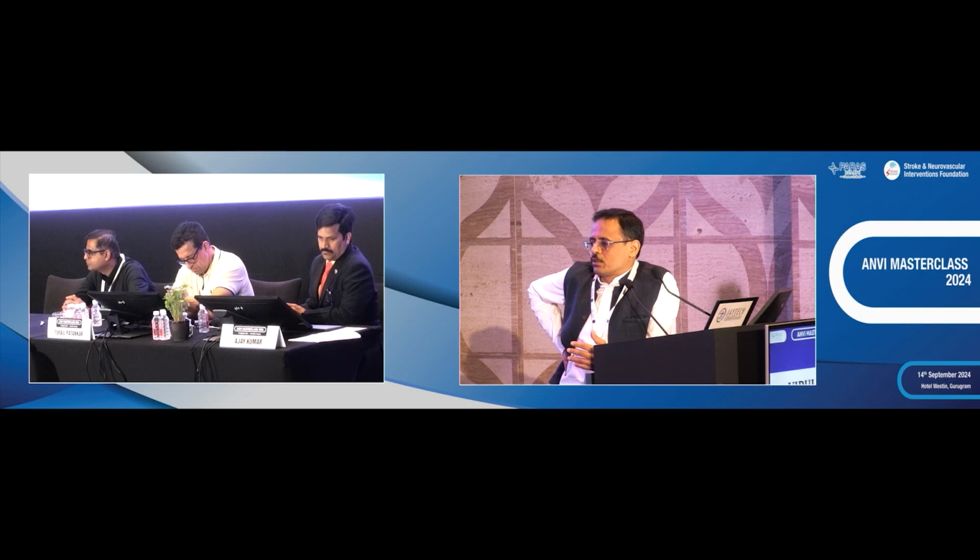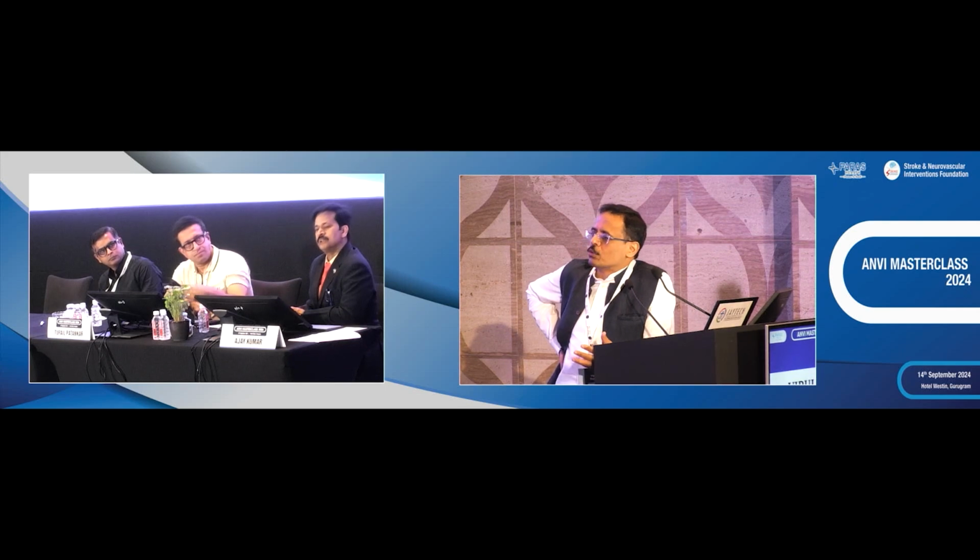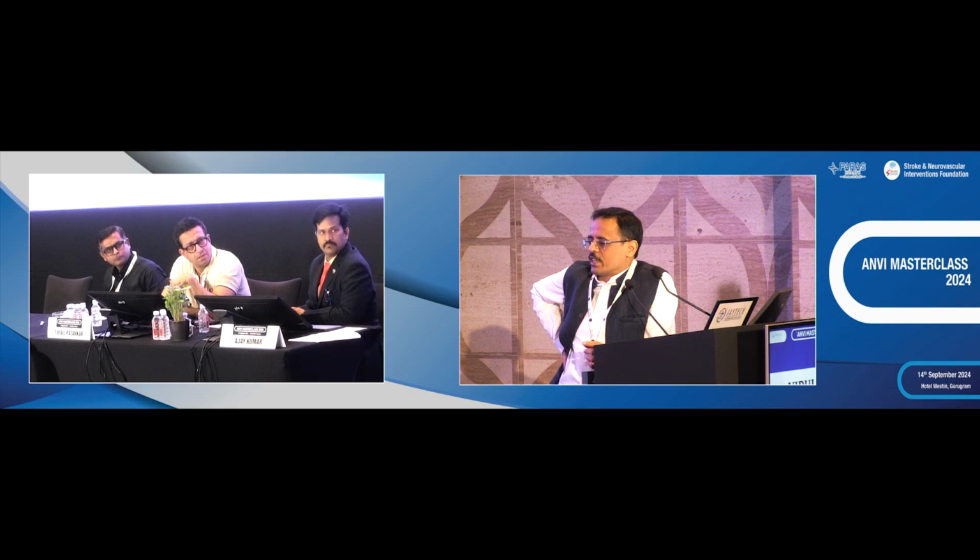So in fact, as soon as you do the angioplasty, until it looks great, unless the clot burden was large and the plaque is very, very small, you may get away. Otherwise, angioplasty is almost needed. So we don't wait for complete occlusion. As soon as we see it closing down, we recross, do angioplasty, inject antiplatelet agents. I think the waiting stage is after angioplasty and antiplatelet agents. At that stage, really the waiting comes in, whether we can get away without a stent or not.